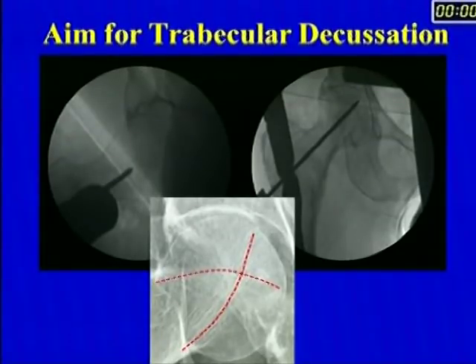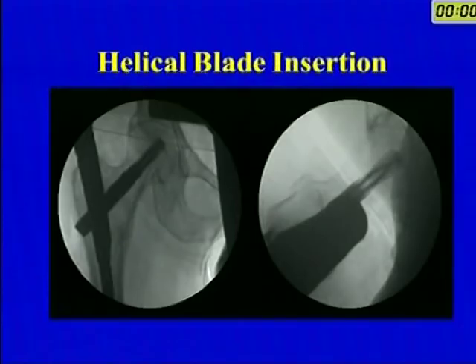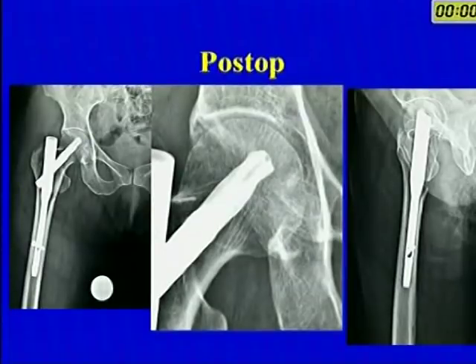Put in the guide wire, and what you see here is actually where you should be aiming, where the compression and the tensile trabeculae decussate, the center of the head. That is where you have the maximum amount of bone and the maximum amount of purchase. And if you start aiming for this, as you go in at this portion, you will definitely feel the resistance, which leads ultimately to an uneventful healing.